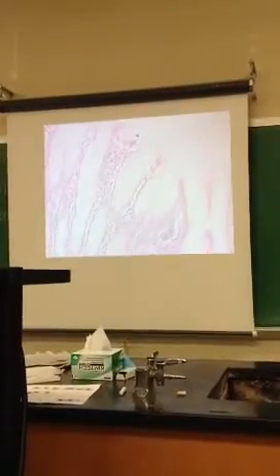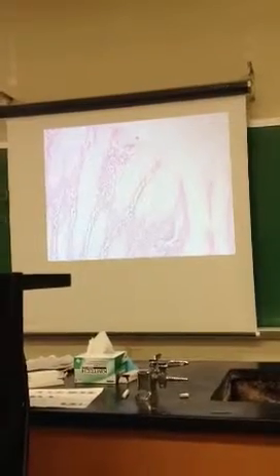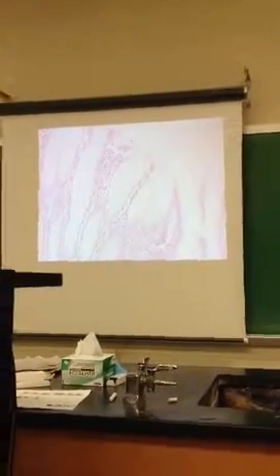The simple columnar looks weird in this one, but it lines the what? What are all these gastric pits? So again, the gastric pit would be asked more with a pointer here to ask what's the opening at the end of the pointer, and that's the gastric pit. Lamina propria, again, would be any of the background cells here. Then we have the gastric glands, which are any of these structures down in here.